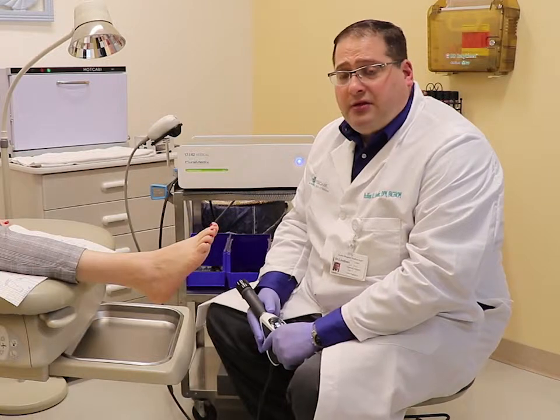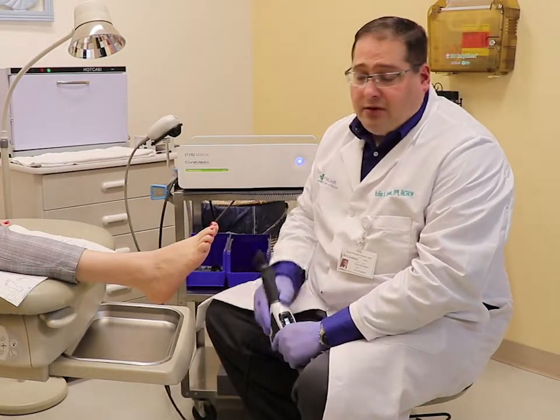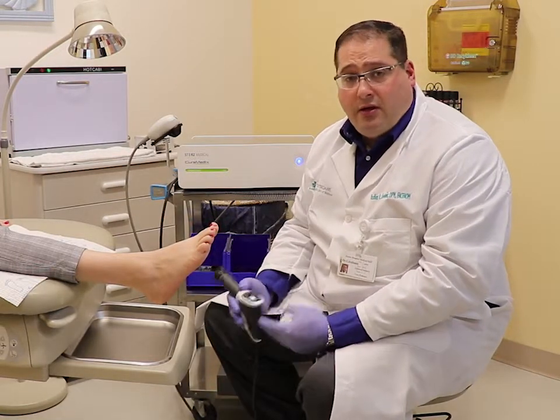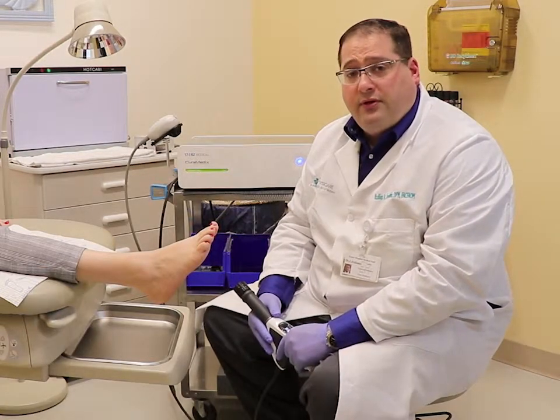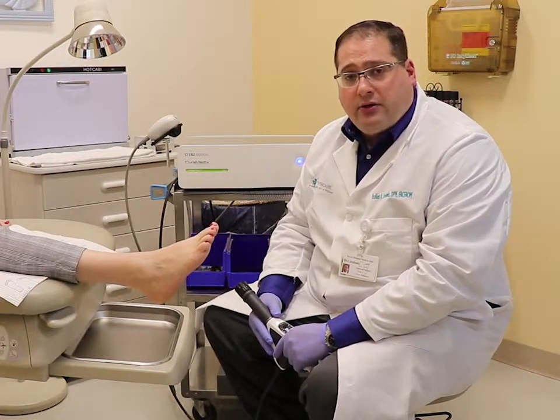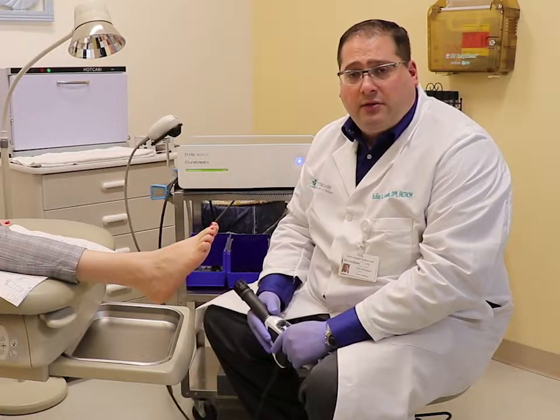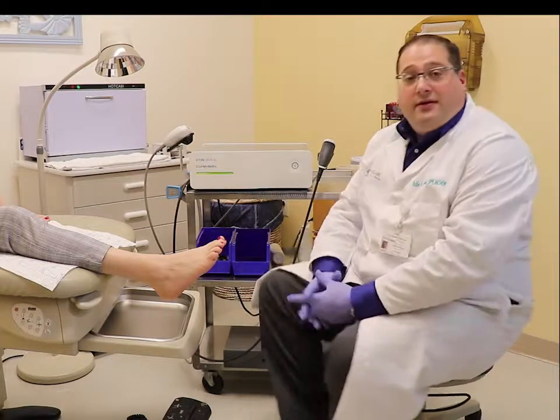This is technically considered a cure for plantar fasciitis. There is no medicine applied to this to mask any improvement — the improvement that you feel is your new baseline. This is an FDA-approved treatment for plantar fasciitis and Achilles tendonitis. It is not covered by insurance, but it is priced competitively with orthotics and some of the other more common treatments as well. Thank you.